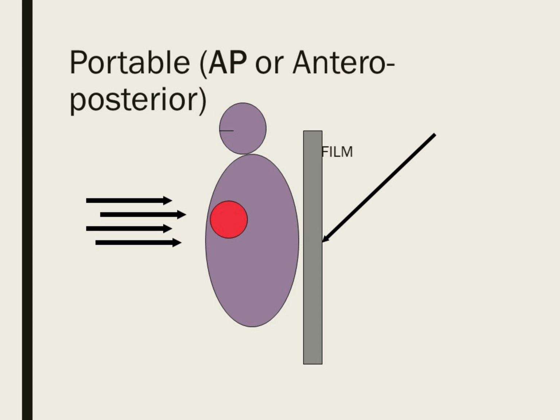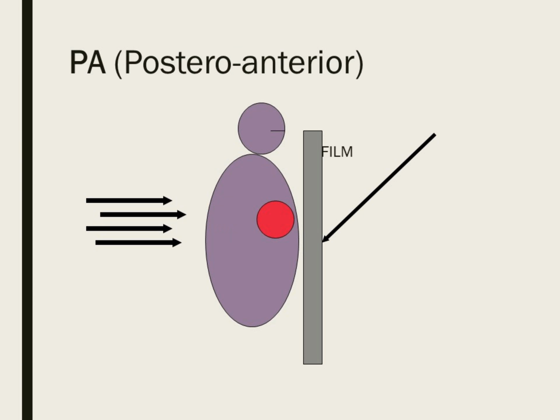If you go to an X-ray suite, it's just the opposite. There's a PA, pretty much. The patient is facing the film in front, and they shoot from the back. Does it make a difference? Yeah. I assume you're going through more tissue or less tissue? Well, the tissue is about the same. There's one thing: are we symmetrical inside our bodies? No, we're not, right? The heart is more anterior than posterior, correct? So when you shoot from the front, you're hitting the heart first. So the heart is going to create a much bigger shadow in the back.